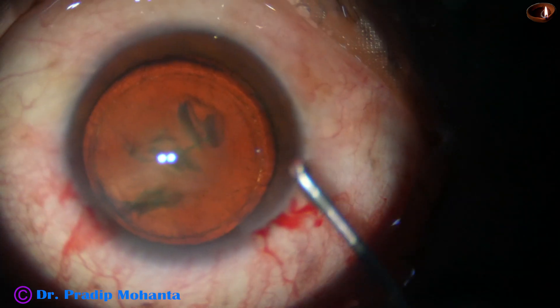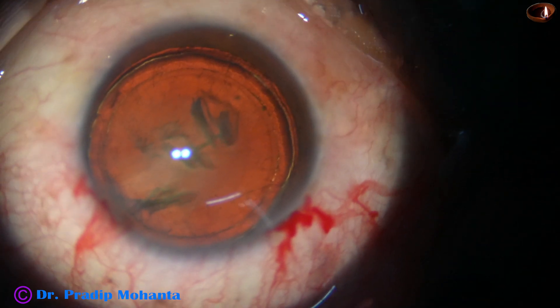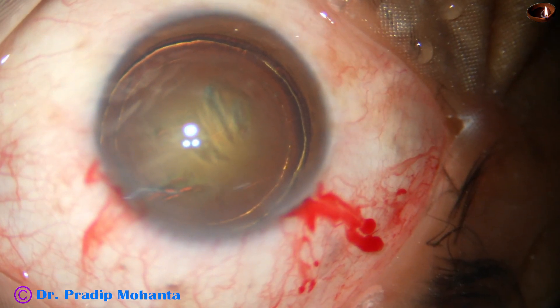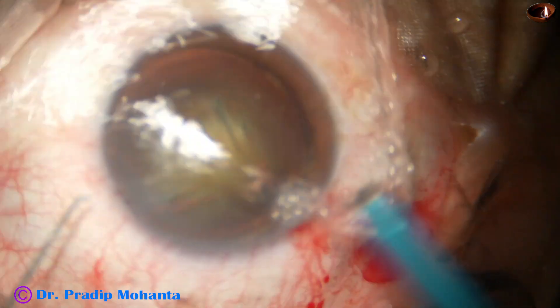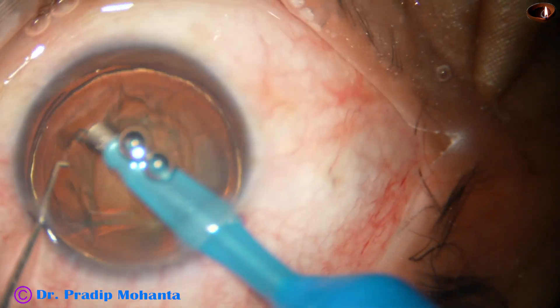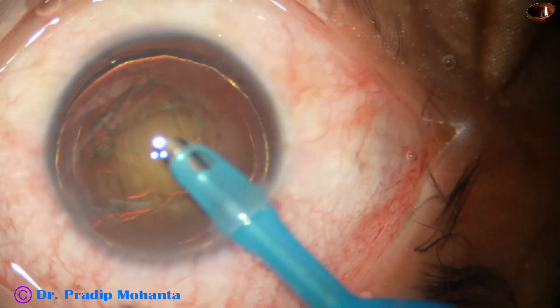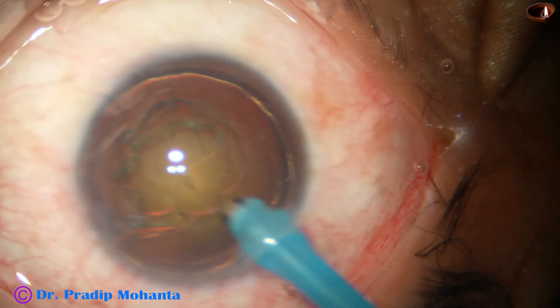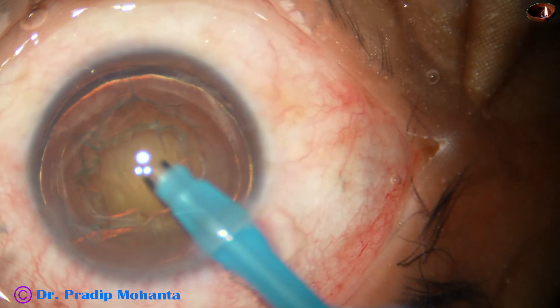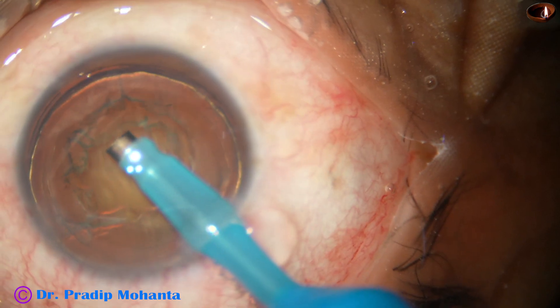The nucleus is stabbed and the anterior chamber is again filled up with viscoelastic. Now let us observe the direct vertical chop. The phaco handpiece goes in with its bevel down, and some superficial cortical lens matter is removed. Now the tip of the handpiece is turned to make the bevel off, and the tip is buried into the substance of the nucleus to achieve total occlusion of the tip.